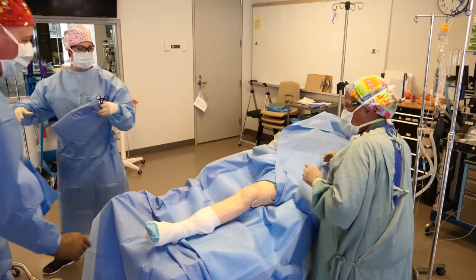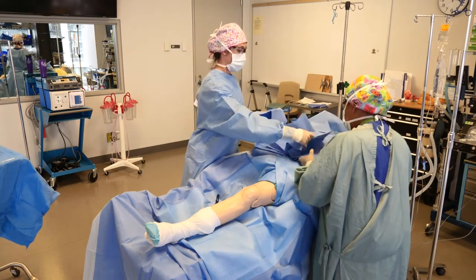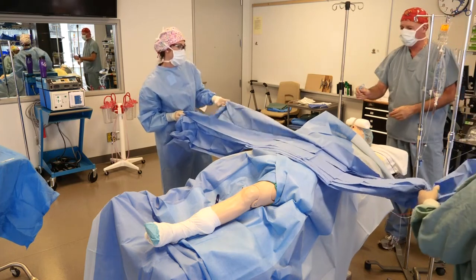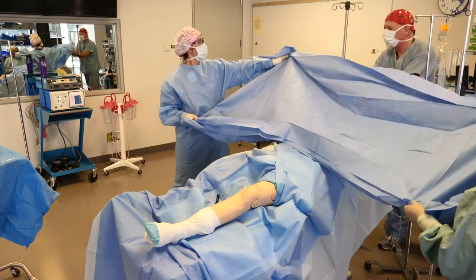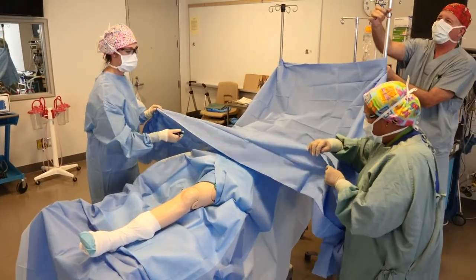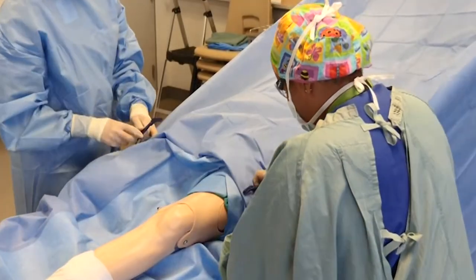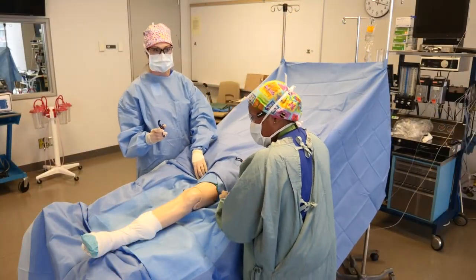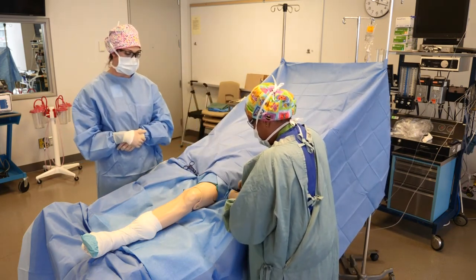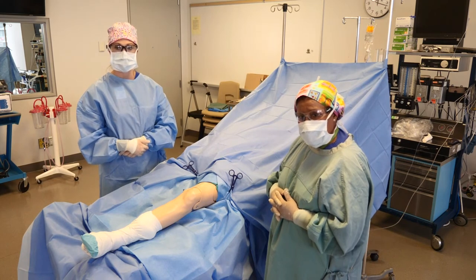The last drape is a square drape sheet which will be applied at the top of the OR bed over the patient's face. The circulating nurse secures the top of the sheet onto the IV poles. We have the scrub nurse and the resident securing the sterile side of the drape with sterile towel clips. When securing drapes onto the sterile field, you have to make sure they're atraumatic to prevent perforation or strikethrough in the drapes.